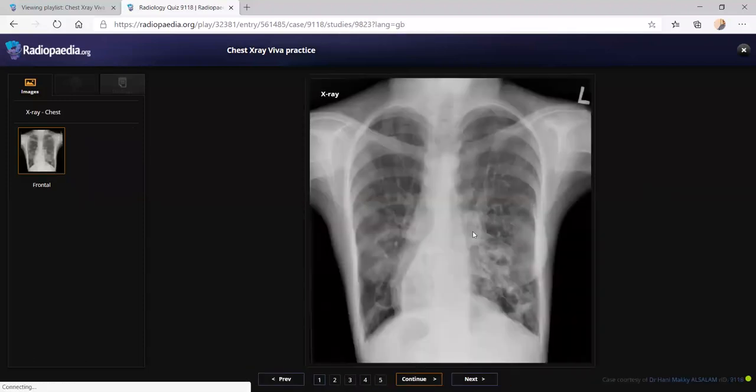And this one is actually given as a first film. You have to hit it for a six. You did not tell about the gastric gas shadow on the right side. Otherwise, there was extensive tubular bronchiectasis, ring shadows, everything was fine. Then you have to ask whether this patient has any sinusitis. Any infertility? It is a male, yes. So male with infertility and sinusitis, then you will get the paranasal sinus X-ray, then you will get the CT. You have to go with that discussion.